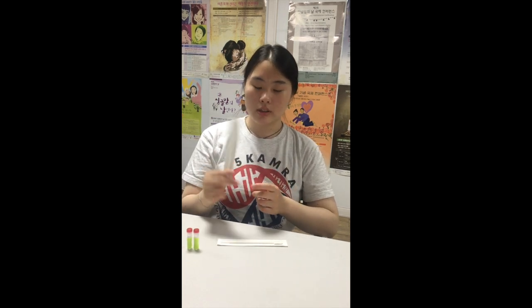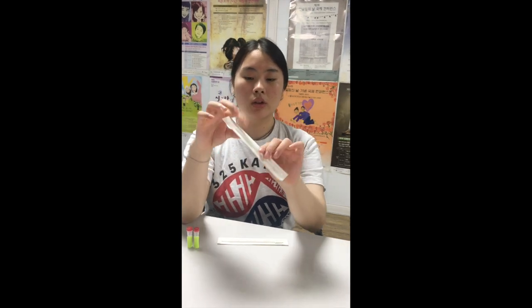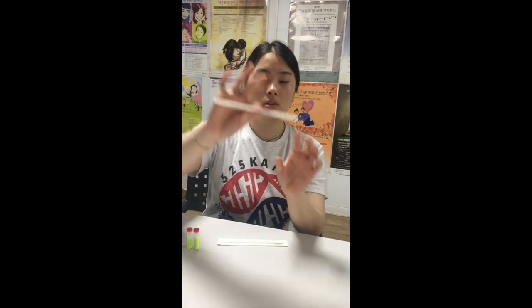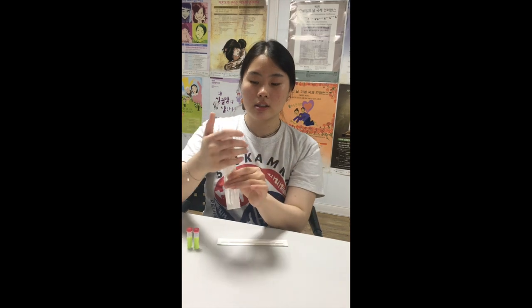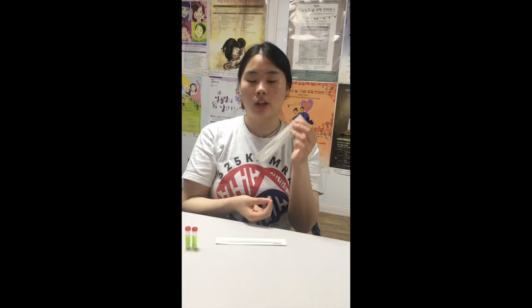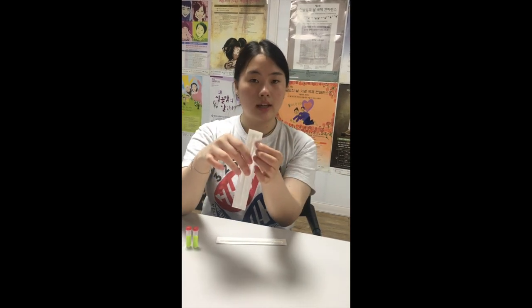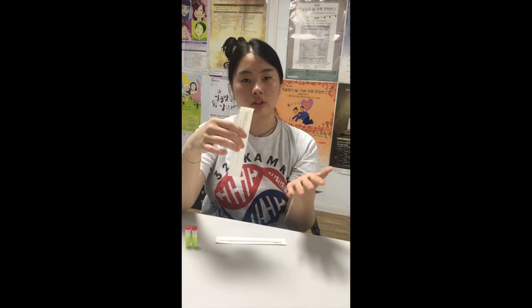Please do not touch the cotton part of the swab, nor do you want to hold the swab by the end — this is where you push it in. If you touch it, the swab might come out and you might be unable to use it. This cotton part is for collecting your DNA, so if you touch it as well, it also becomes useless.